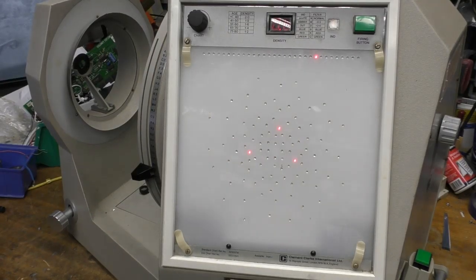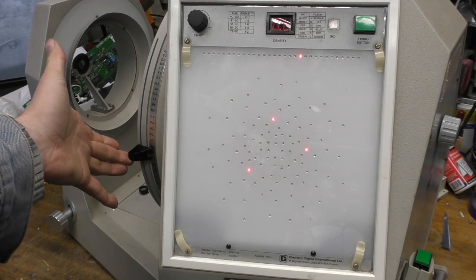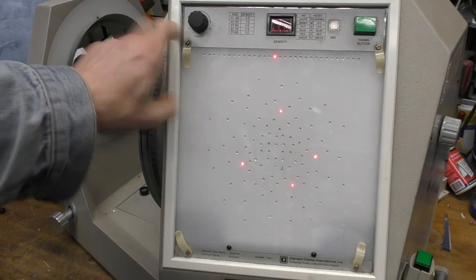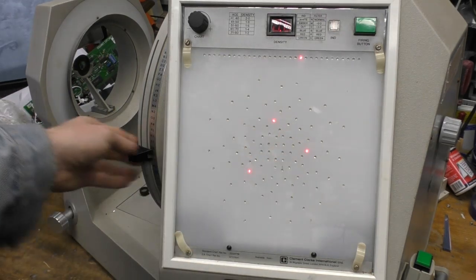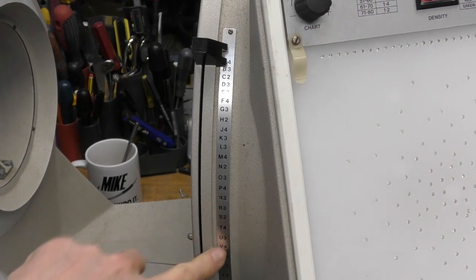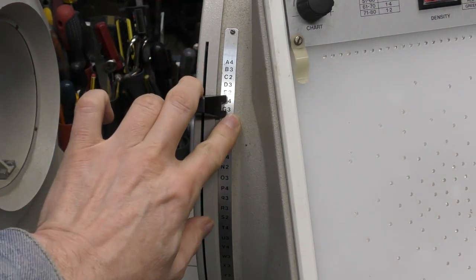And on the front, we've got a number of controls. This lever selects which set of dots it uses, and it shows up as this collection of LEDs on the front. There's a line along the top which shows the pattern number, and then these LEDs indicate the actual pattern selected. There's also a label on here with A to Z, and then upper and lower case letters, but also a number showing how many dots are present in that particular pattern.